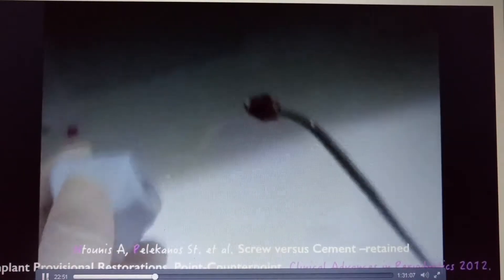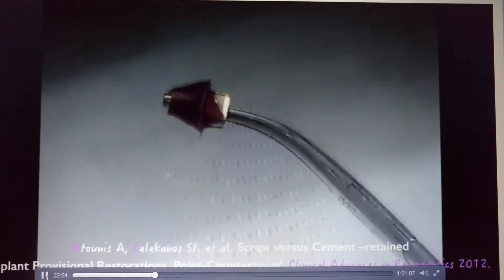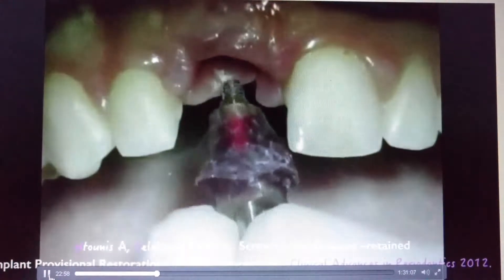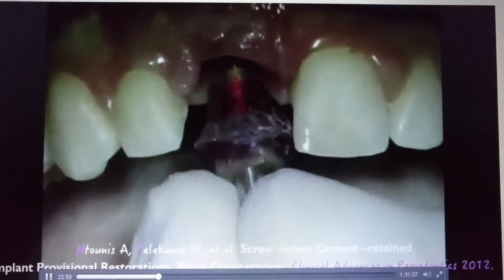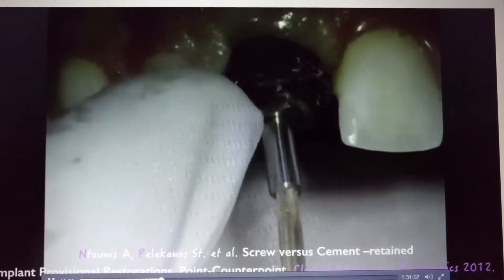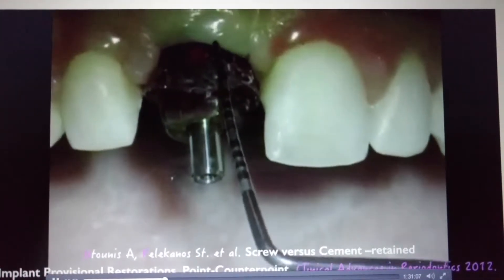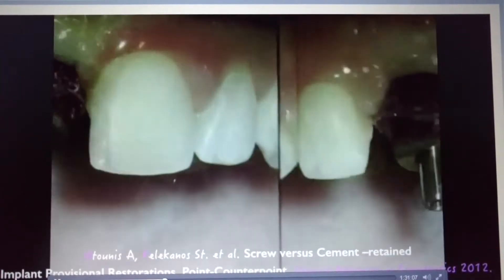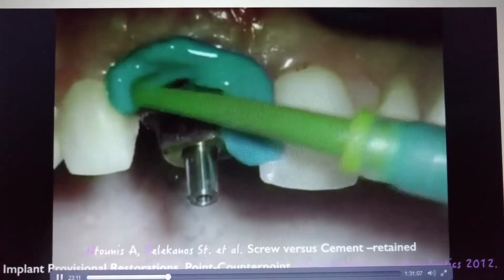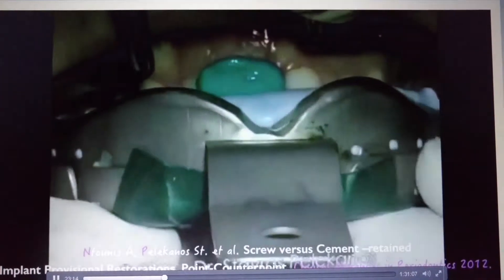Without that process, the lab misses the information. And all the work that we've done all these months by trying to create that emergence profile around that provision is lost. We make the impression the regular way we make the implant impression — you can use PVS or any other impression material of your choice.